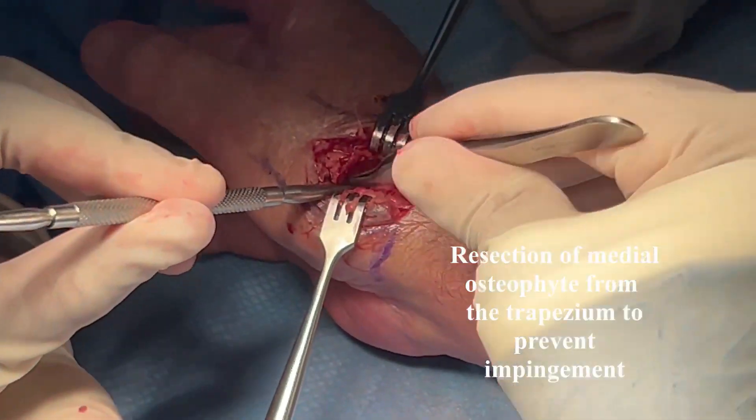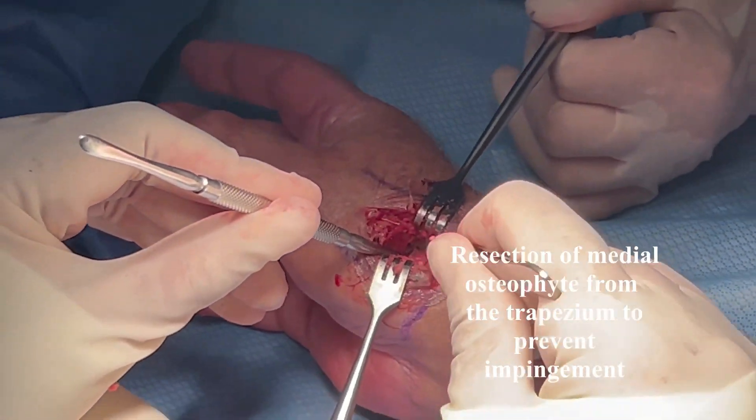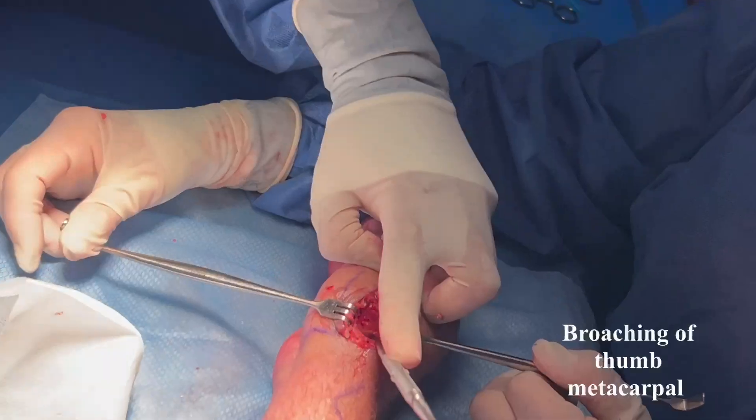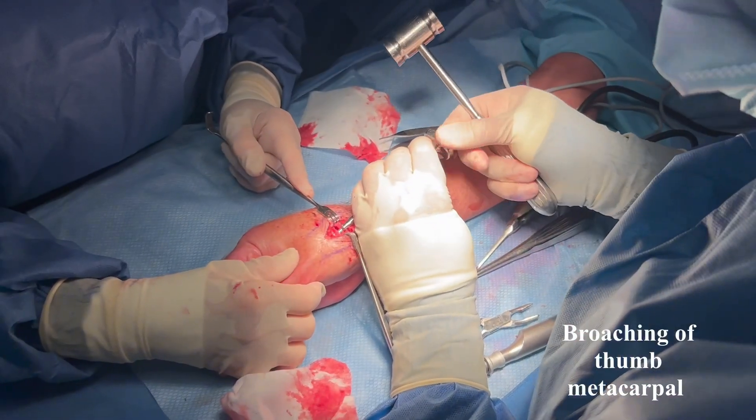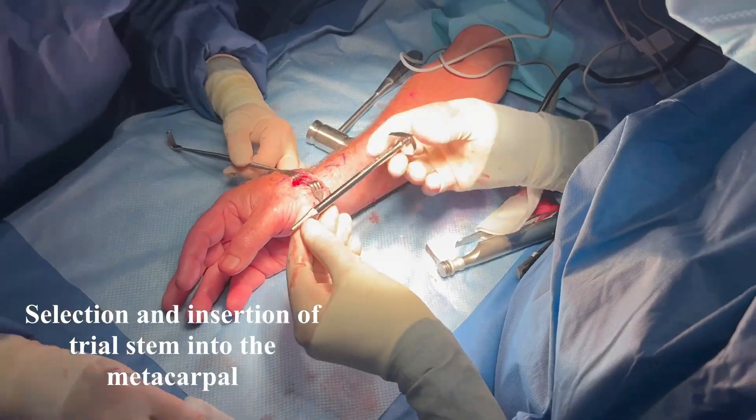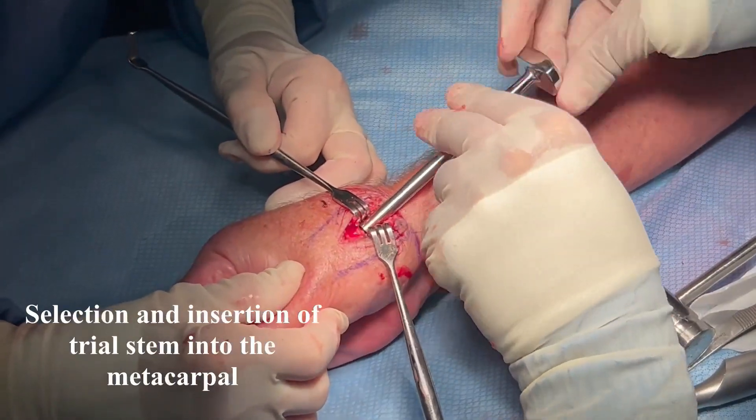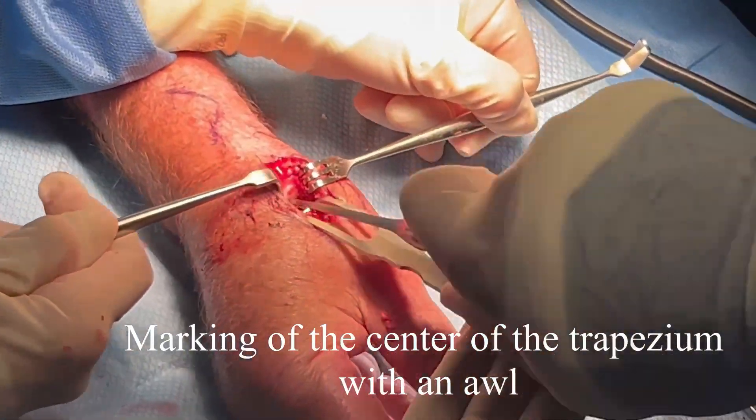The medial osteophyte needs to be removed with a rongeur or an osteotome. The metacarpal is prepared for implantation with different broaches.